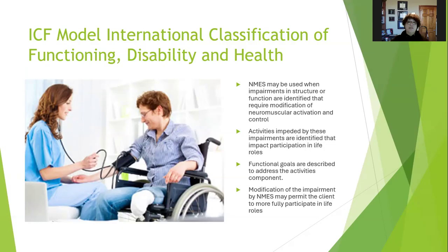A good example of this that I've seen in the clinic is we'll use the functional electrical stim bike, and there are lots of different reasons why you want to use it. So you have two 6-channel stimulators, so you have 12 channels, and you set them up for functional activity. You have electrodes on quads, on hamstrings, on glutes, on tibialis anterior, on gastroc, and you can have channels on abdominal muscles if that's something that you're working on. So all of those stimulator activities allow the person to ride the bike, but then we have to translate that into functional goals.